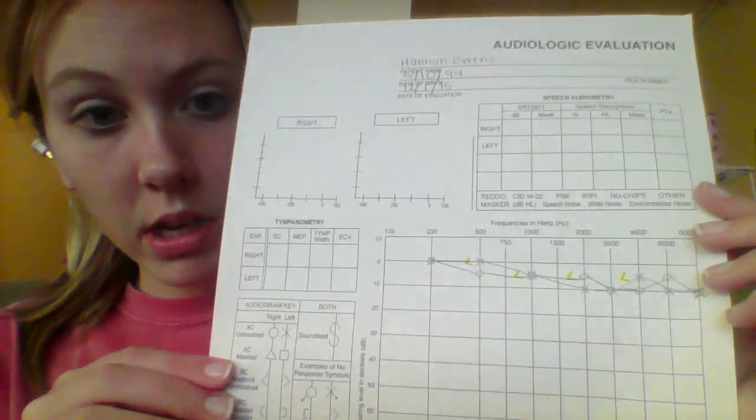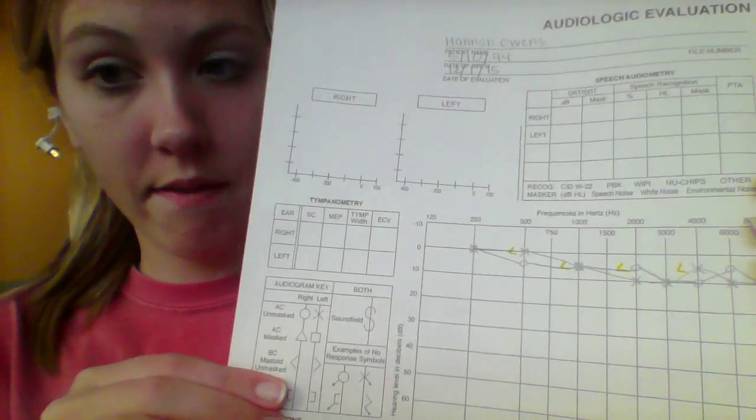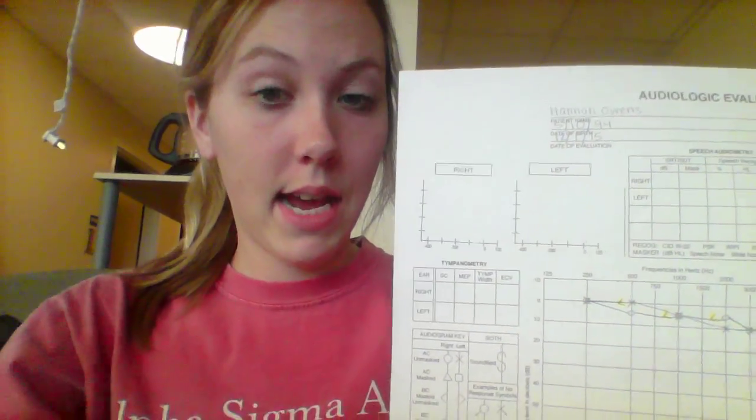So when we did bone conduction, Hannah was hearing the sounds just like she normally would have, but the pathway of the sound was different. It was coming from the vibrations of her skull to the inner ear to the brain instead.